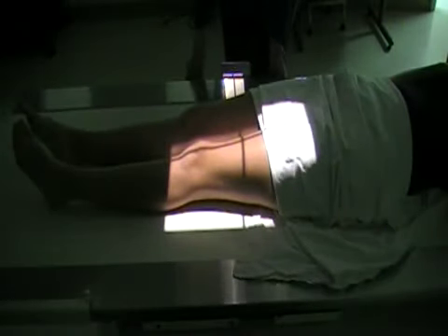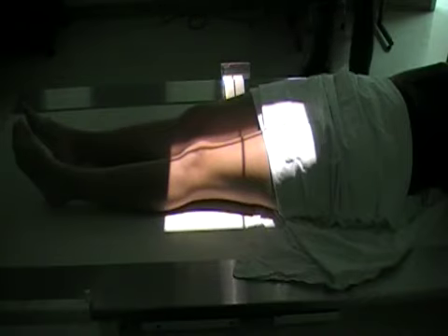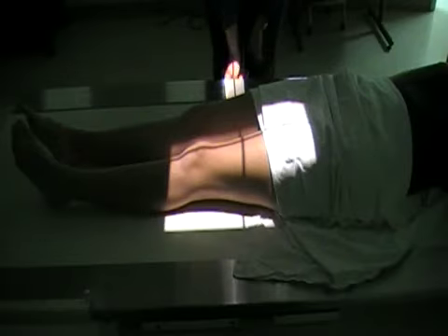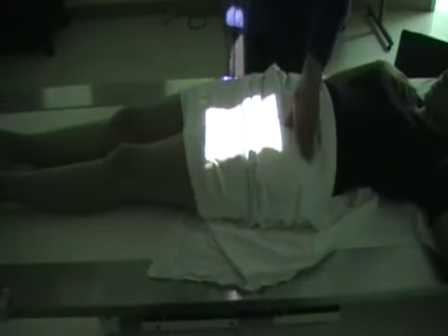Okay, now we'll change out the IR and put in a 10 by 12. Okay, so now we will get the proximal portion of the femur.